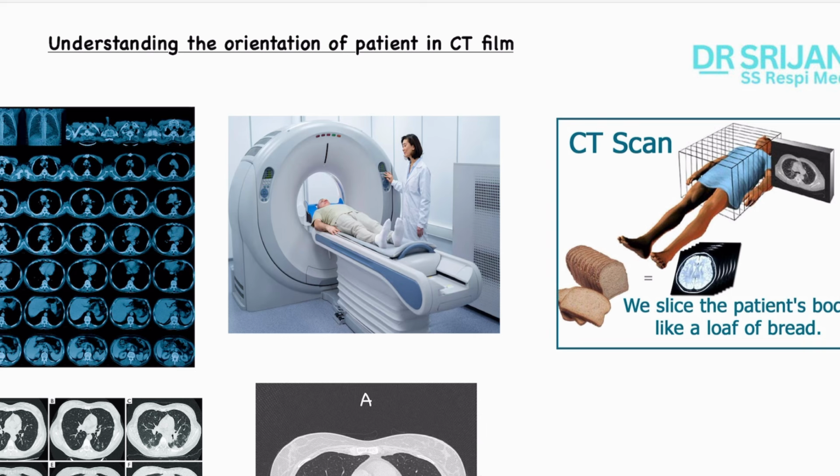This three-dimensional imaging is very crucial, because once you imagine like this and you start reading from the CT scan, you'll see that progressively, while you go down, you are able to correlate more easily.